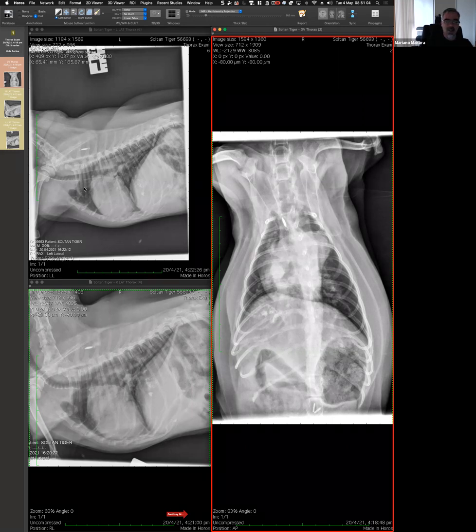I'll try to find later on a case of a hard one. Obviously, I'm not gonna tell you, and I'm gonna mix it with other things, so then you're not expecting it. Yeah, I enjoy going to topics like this one, because compared to last time, extremely different radiographs, same disease. So thinking about it again is very useful. I may visit pulmonary hypertension again.